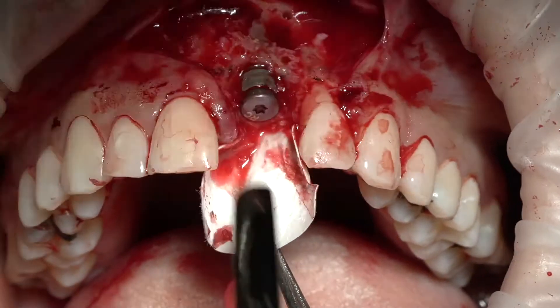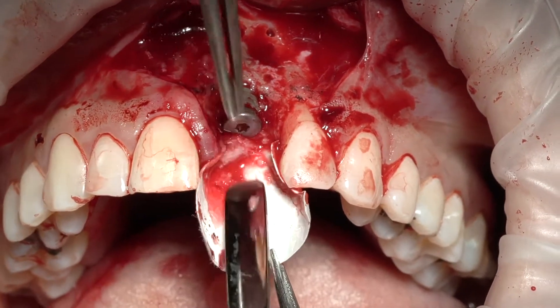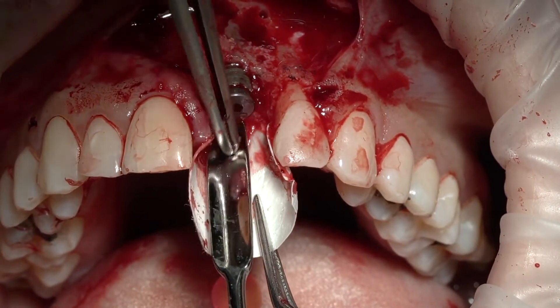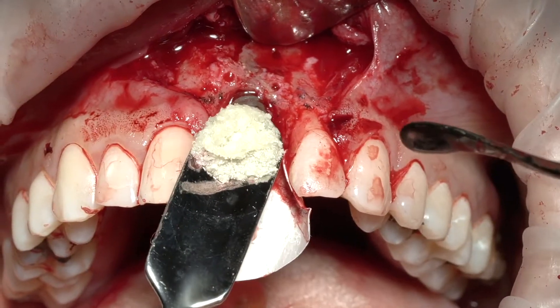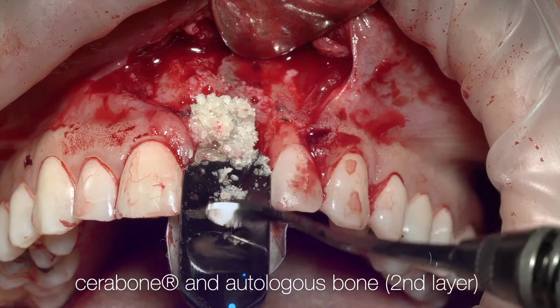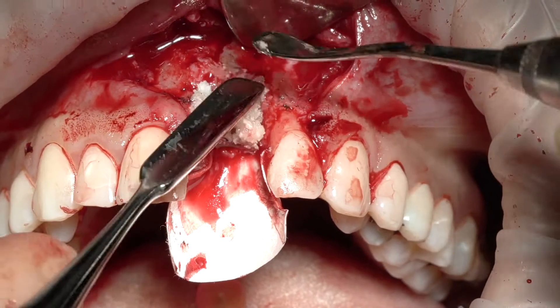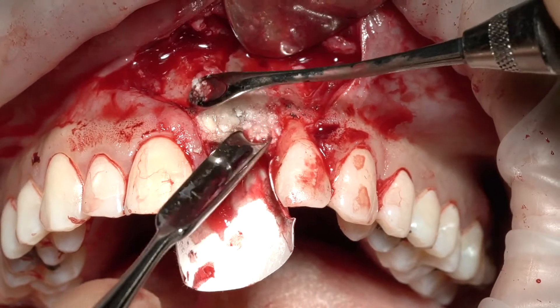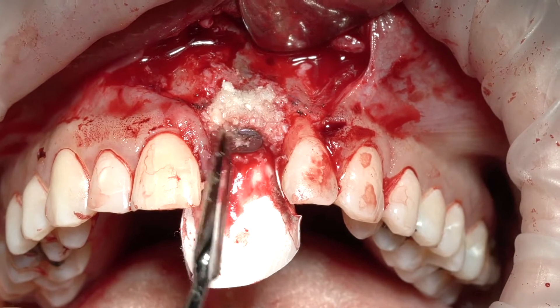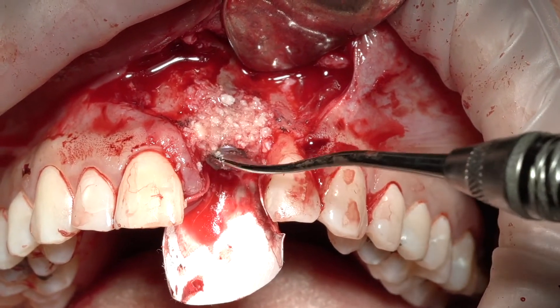Now we're making sure that our palatal defect has been grafted nicely, but more importantly has a barrier stopping fibrous tissue from coming into the area. That's my allograft — it's Max Graft, Human Tissue Bank, from live donors. We're using that to pack the mesiodistal gaps and the labial. We're grafting even to the level of the healing abutment — not only to implant level but above it, to give good support and ensure this bone lasts longer.